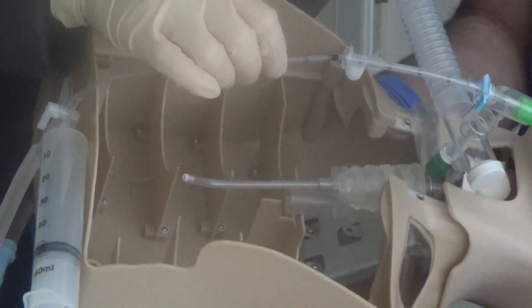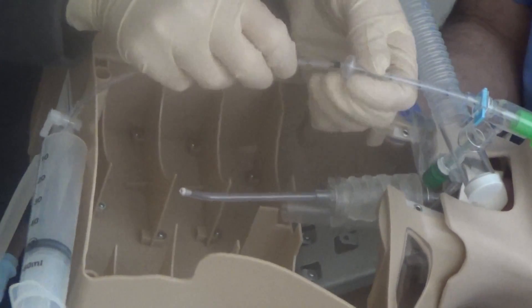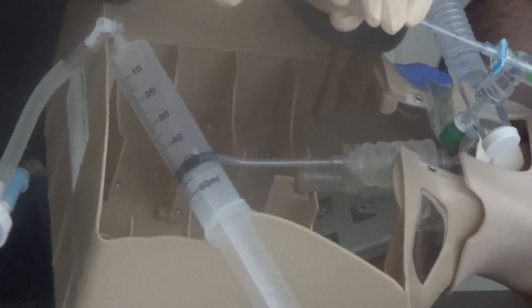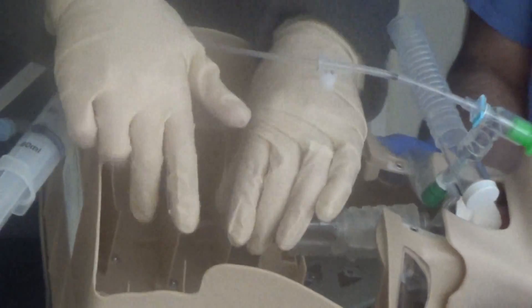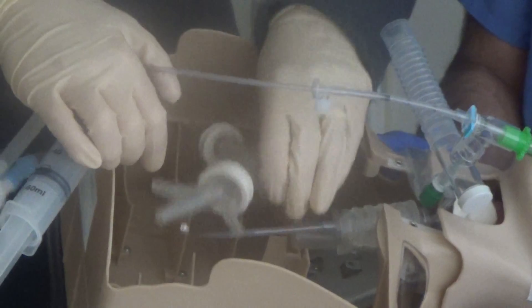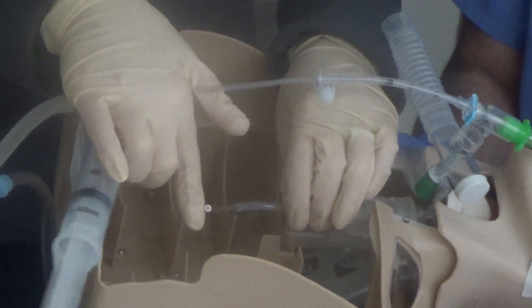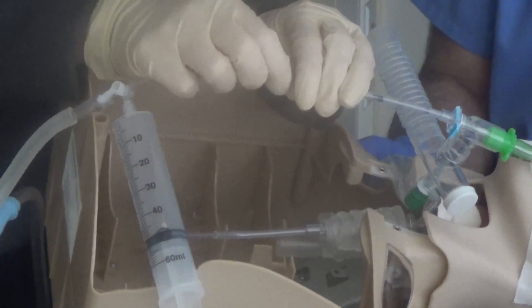From this position, I want to advance the inner catheter as distally as possible, out into the distal airway, which is where we will be installing the saline. You'll notice that as I advance the inner catheter, it passes out of the outer catheter. The position I want to be in — as distally as possible — is where I will feel a wedge. Because it is blind, simply advance the inner catheter until you feel resistance.